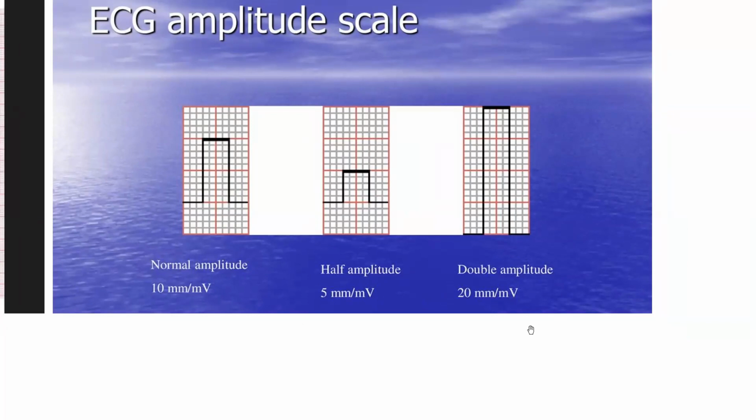20. So understand that despite the fact that you're looking at a normal looking ECG, if this is the standardization mark, you have to understand that it has been amplified or multiplied. So when would you have such a mark? Well, in patients who, for example, have obesity, when they have a big chest or maybe a barrel chest, that means to say that the complexes that you will see normally would be very small.